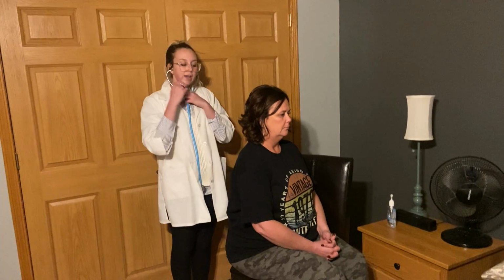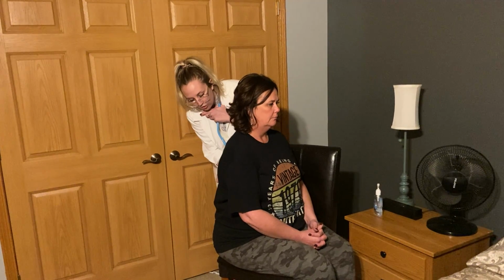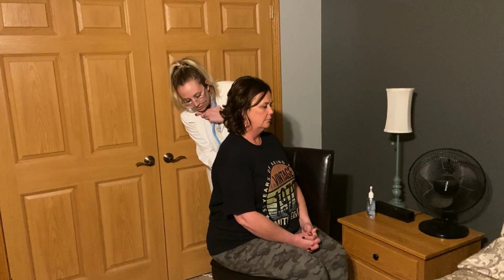So, to complete my respiratory exam now, I'm going to listen to the back here. I'm going to start at the base of her lungs, go across, and make my way up. For these ones, Rhonda, I'm going to have you take nice deep breaths in, okay? So go ahead, nice deep breath in. Good, I'm going to move to the other side. Good.